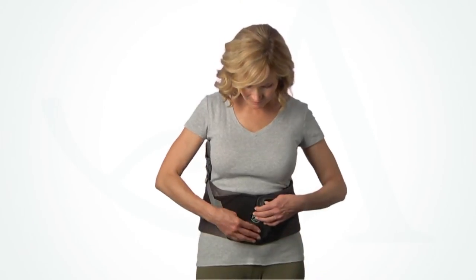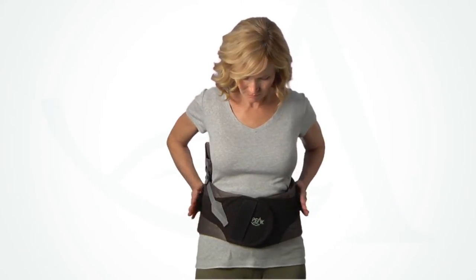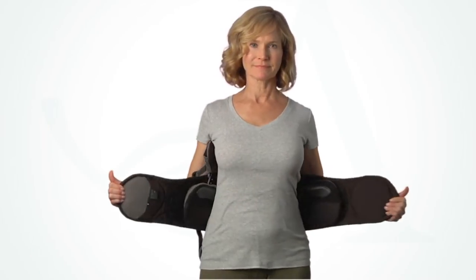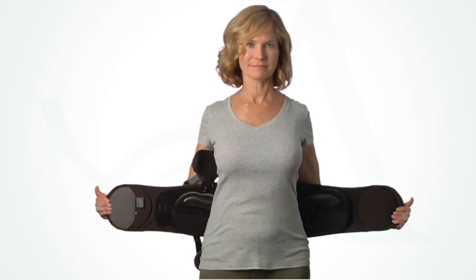To remove the brace, peel the pull tabs and reattach them as close to the back panel as possible. Peel back the ends of the brace to open. Be sure to fully extend the brace so it will be ready for reapplication.